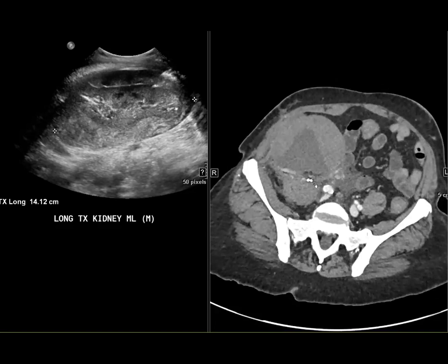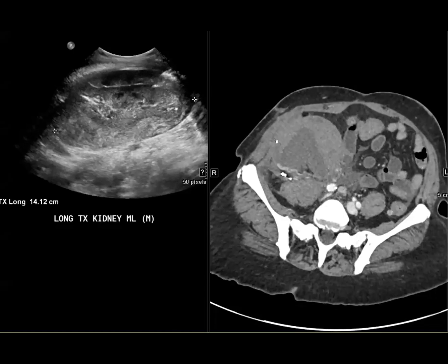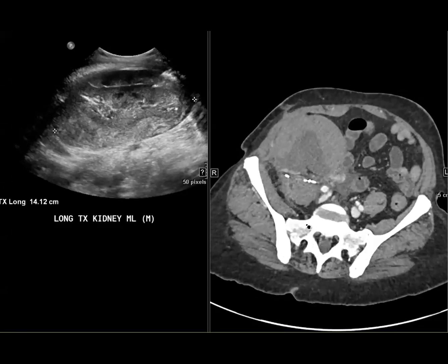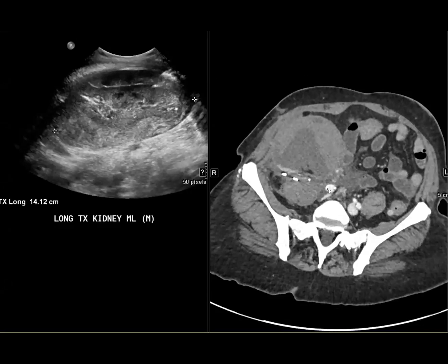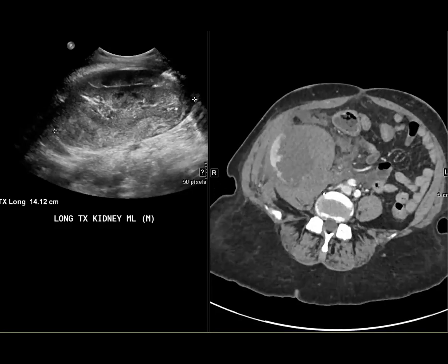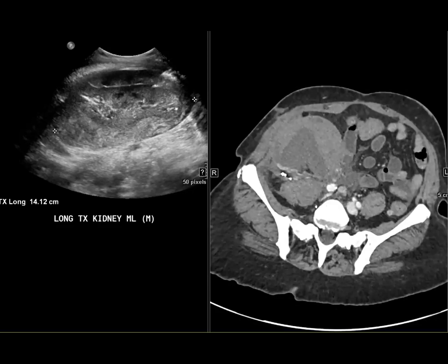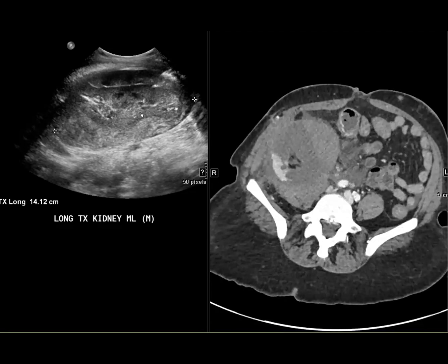The other thing that happened in this case was that because their transplant was older, the surgeon said that the patient has a lot of adhesions. It's not like a hematoma in the immediate transplant setting, so they did not want to go in and immediately evacuate it. So what IR did was put a drain into this and instill TPA into the hematoma to lyse it and try to drain it off. It worked moderately well, but unfortunately this transplant still has not regained function. So it's unfortunate. Perinephric hematoma with reversal of flow on the ultrasound.